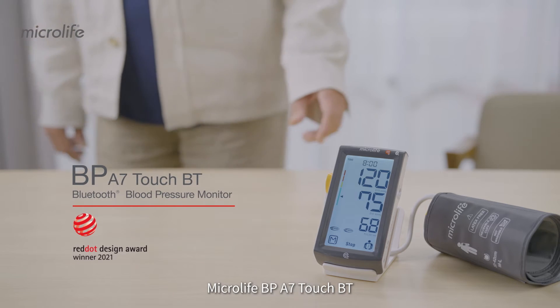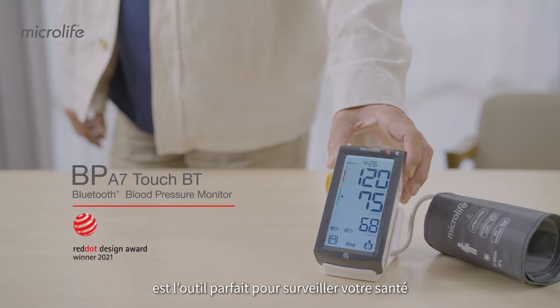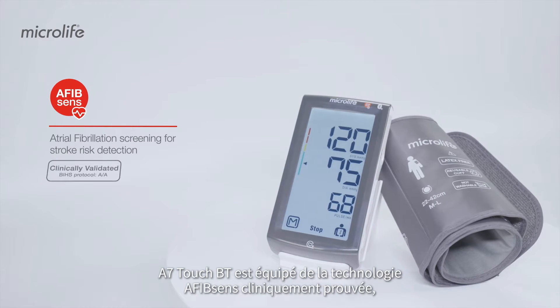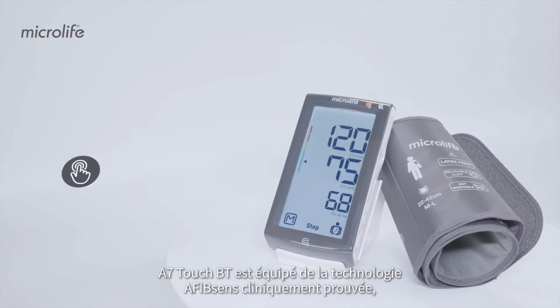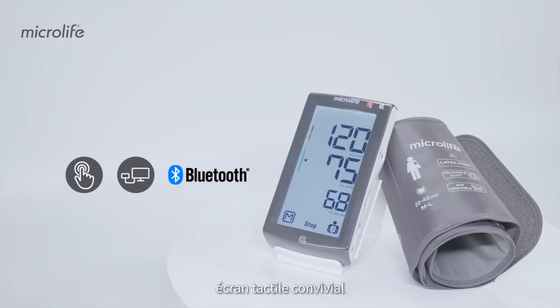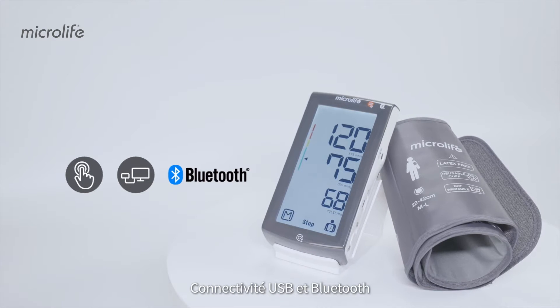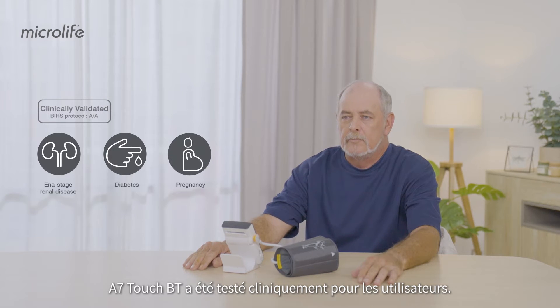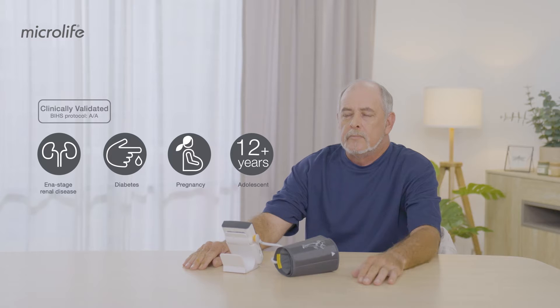Microlife BP-A7TouchBT is the ideal tool to monitor your health. The A7TouchBT features the clinically proven AFibSense technology, user-friendly touchscreen, and USB and Bluetooth data connectivity. The A7TouchBT is clinically validated for general users and users with specific conditions.